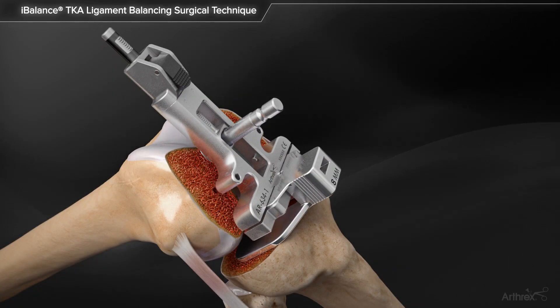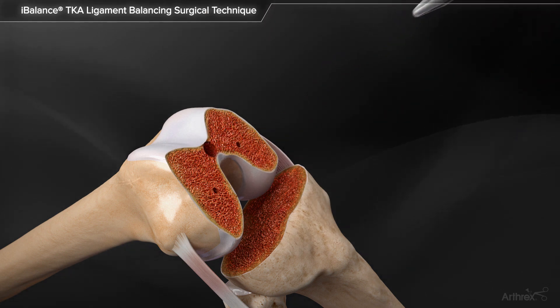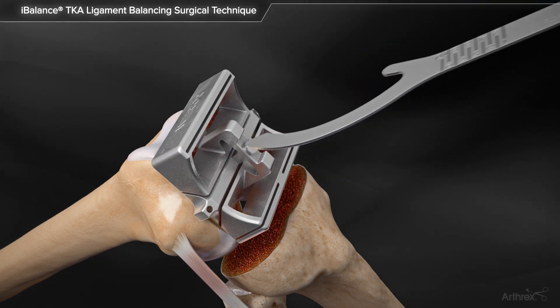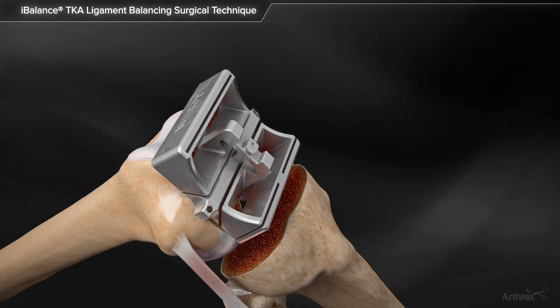The tensioner body and IM rod are removed from the femur. The 4-in-1 block matching the size measured on the femoral sizer is placed under the distal femur and the femoral preparation is completed in the standard fashion.